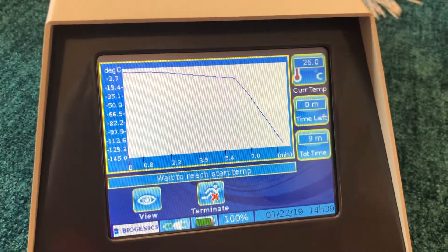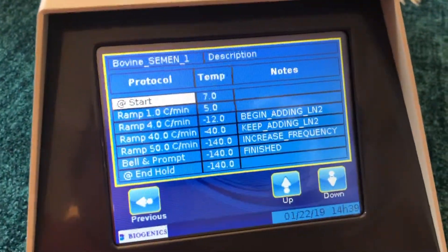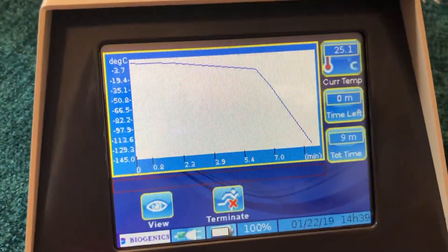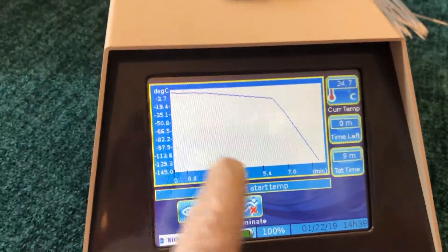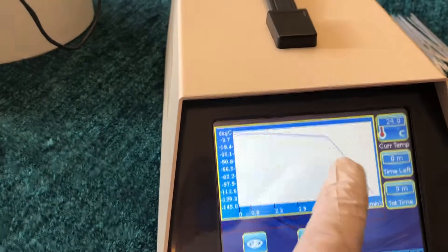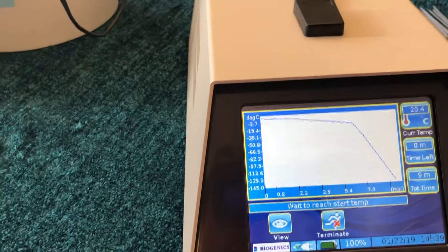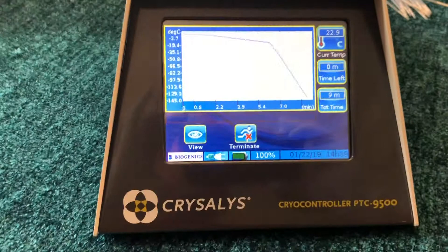Now what's happening is the temperature is going to fall down to the start temperature. Press View and it shows the start temperature is 7°C. I'm waiting for this to get to 7°C, then I'm going to let the program run. The status bar is going to scroll all the way to the sharp knee at minus 12 — that's when the action really begins. I'll add liquid nitrogen to approximate the ramp, and it will produce a data log of every run, stored on an SD card in the rear of the unit.